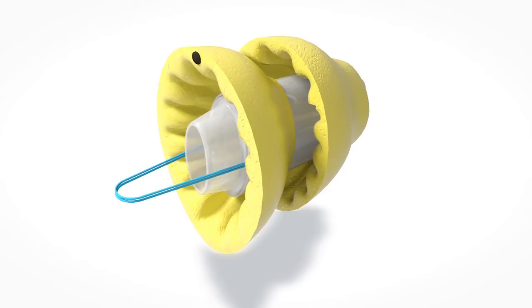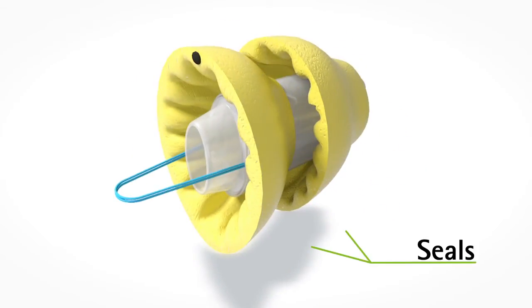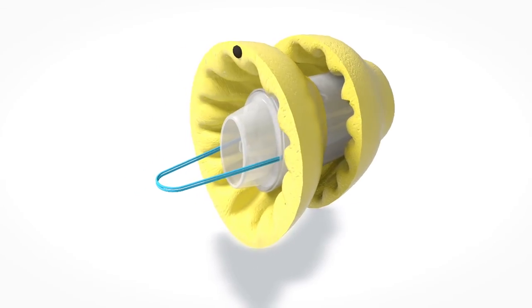Being able to control the properties of the foam used on the seals of the device to make sure that patient comfort was at its maximum and feedback was at its minimum — those are all key technologies that went into the development of the product. We've made the Lyric safe and biocompatible while at the same time protecting the ear and protecting the device. That's sort of the magic.